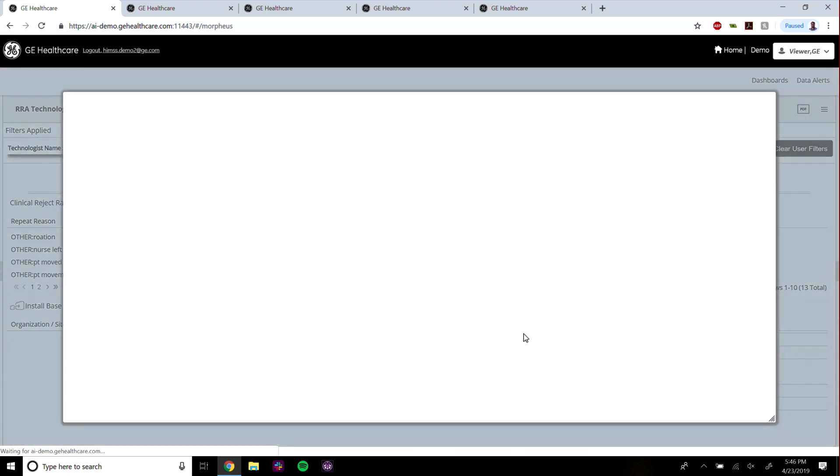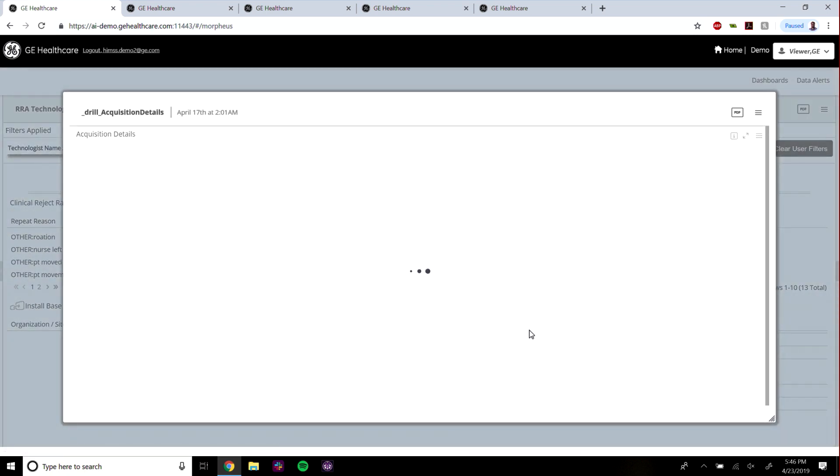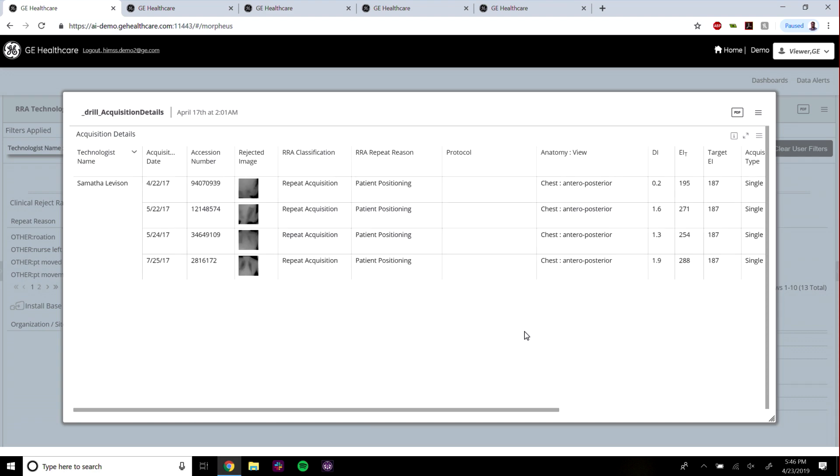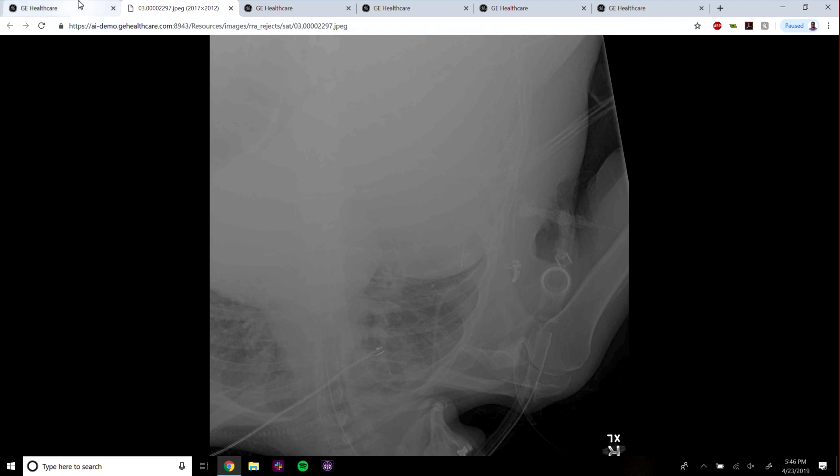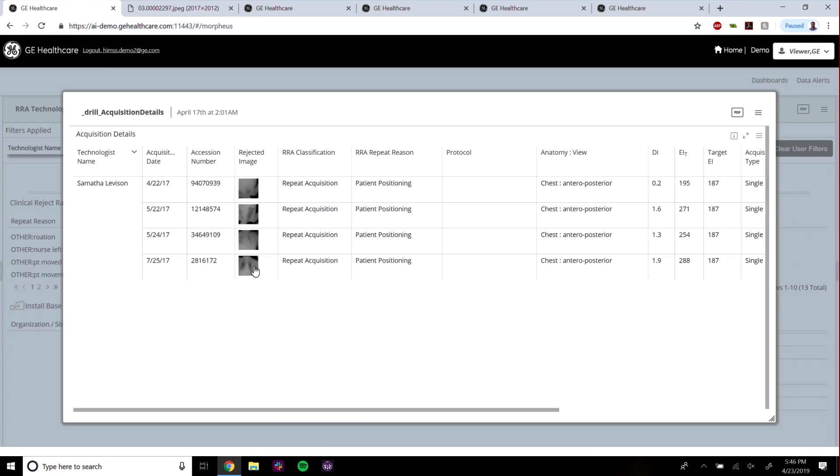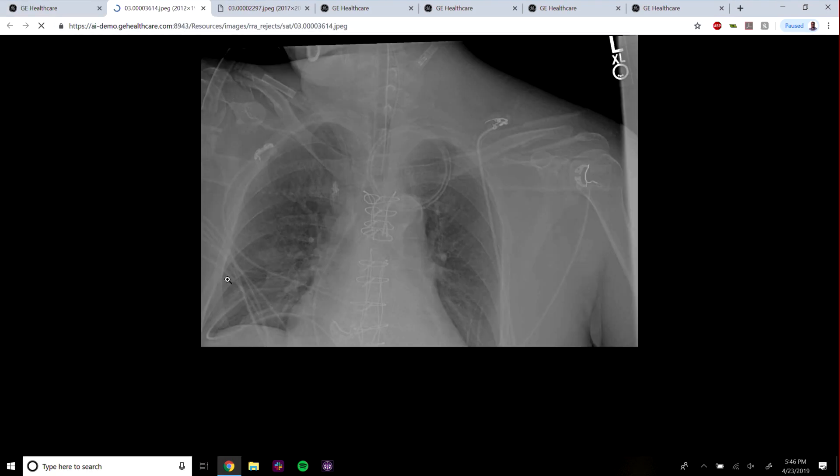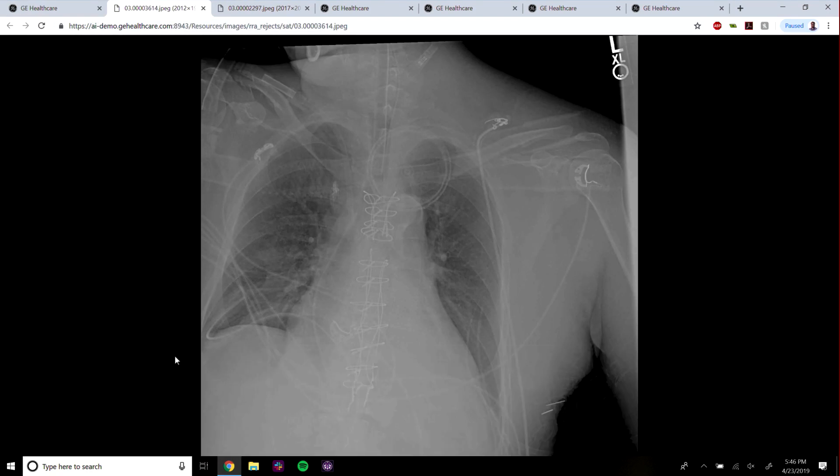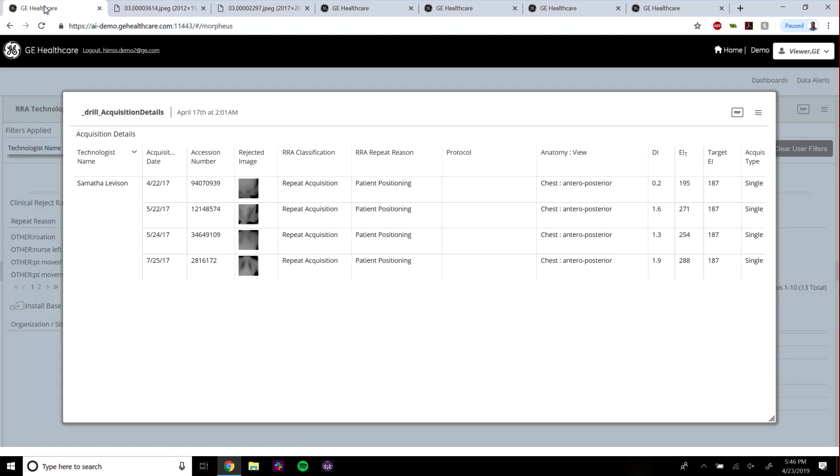We can even reveal the actual images that have been rejected, which historically had been saved only to the devices and extractable by USB. You can now easily click on them and see them within a web-based dashboard and detect trends such as clipping of the bottom lung on these types of exams.